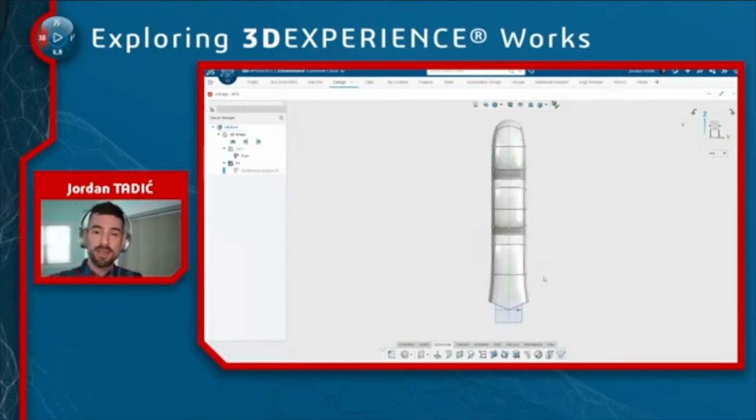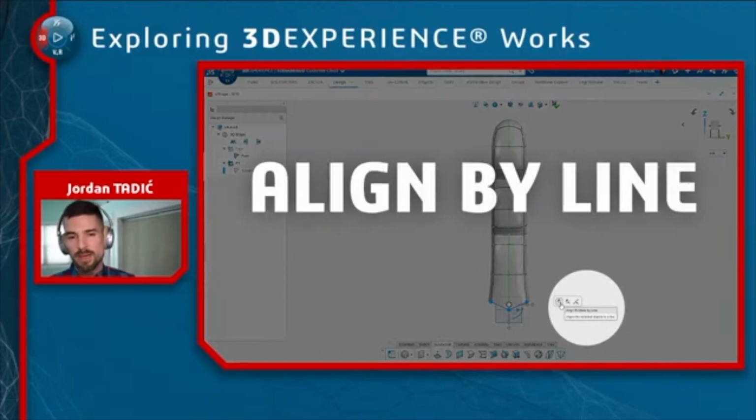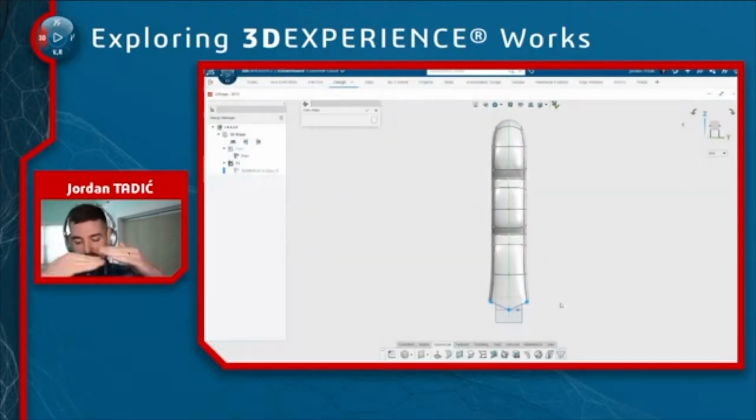So a good shortcut there. Now I'm purposely bringing this out of alignment because even though you showed this last time, just as a quick reminder, I wanted to bring up what the align by line feature does. So if I select all those entities that are misaligned at the bottom of my design, from the context toolbar, select align by line, I can then align them by line so that it flattens that whole surface perfectly. Like I could start a sketch on it if I wanted to. But I could also translate and scale as well.